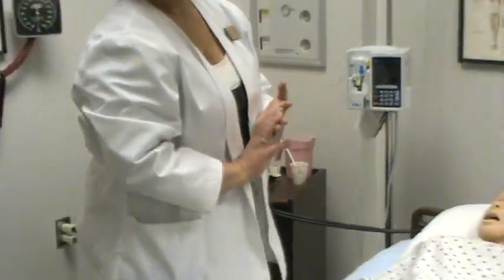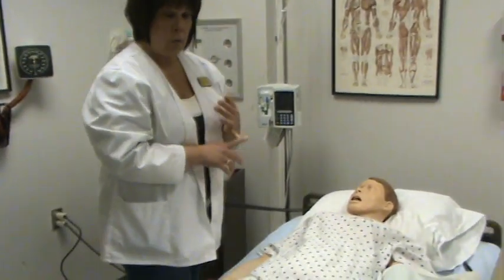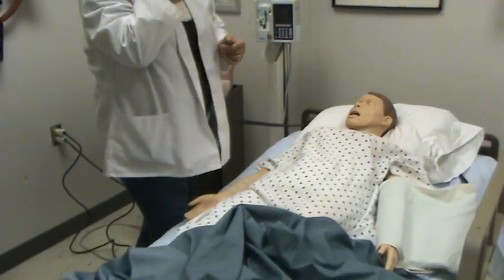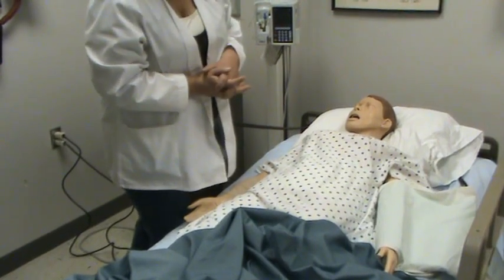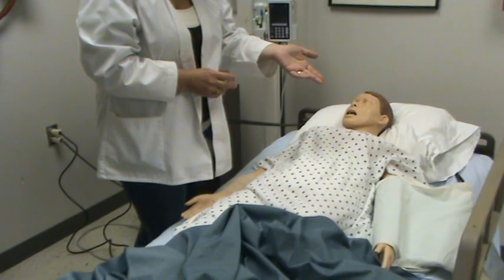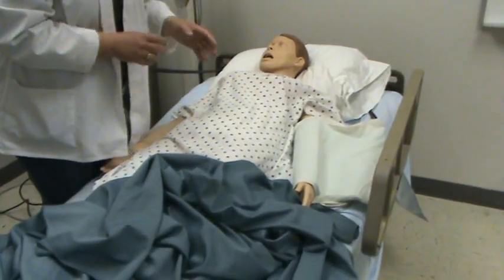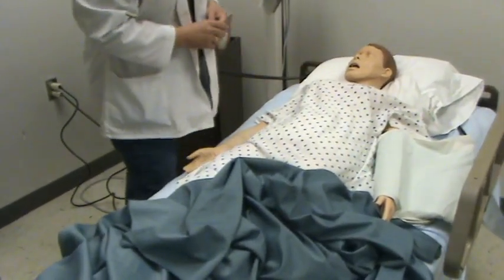You still need to come in every hour and check the CMS. Make sure the skin isn't getting too red - where with cold you didn't want it to get white, with heat you don't want it to get too red. One good example for using the Aqua K pad is if an IV has gone bad and you get phlebitis - you can apply heat to it. Check the color, the motion, the sensation the same way you did for cold.